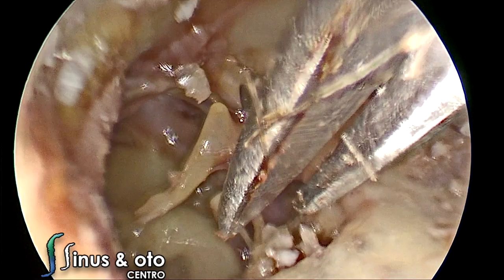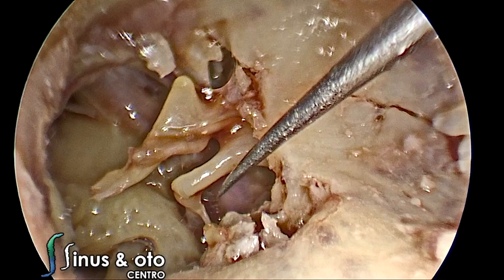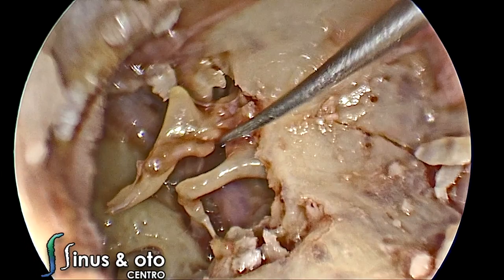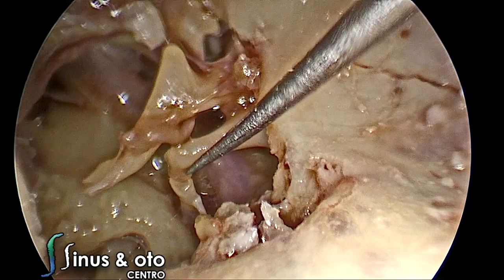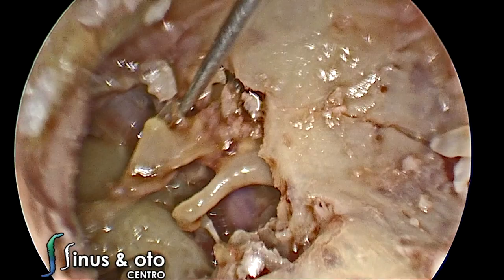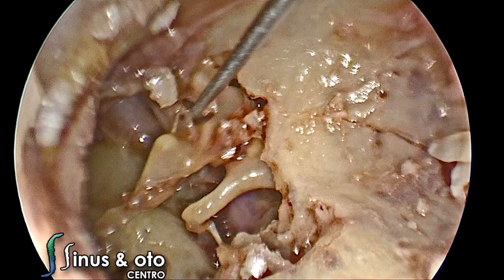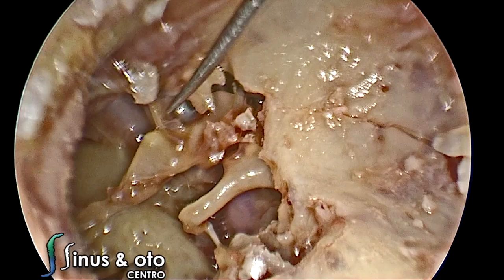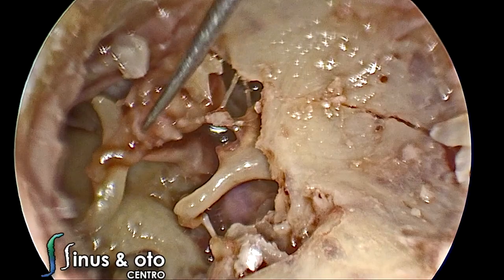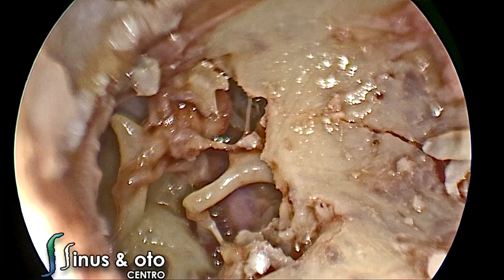Now we are going to cut the chorda tympani to expose better the tympanic segment of the facial nerve and the incudostapedial joint. We are going to disarticulate the incus from the stapes and from the malleus, and also remove the malleus to expose better what we call the epitympanic diaphragm and the tympanic isthmus. We remove the anterior malleolar ligament, which is more tough than the posterior malleolar ligament. The posterior is very thin and easy to cut, while the anterior is sometimes very thick. We remove the malleus and the incus, keeping the stapes at this point.